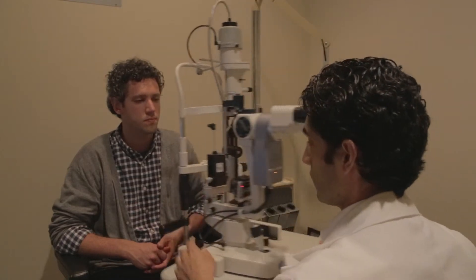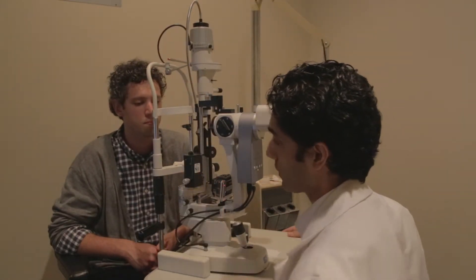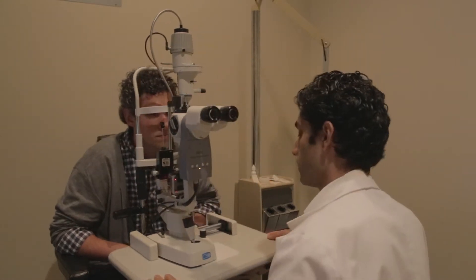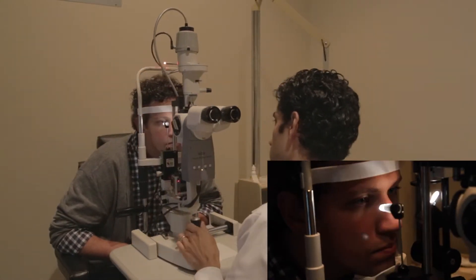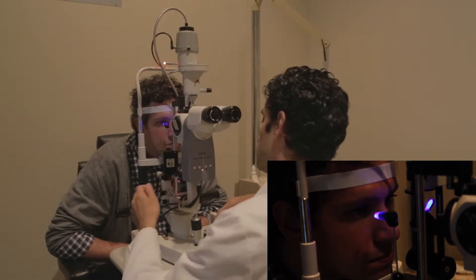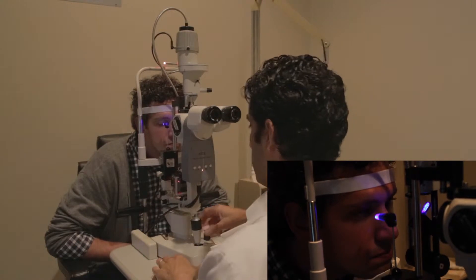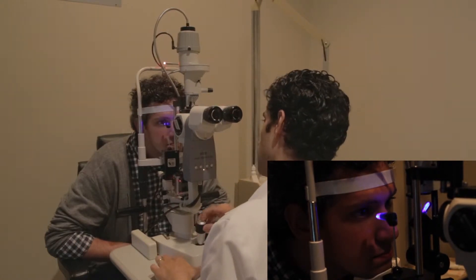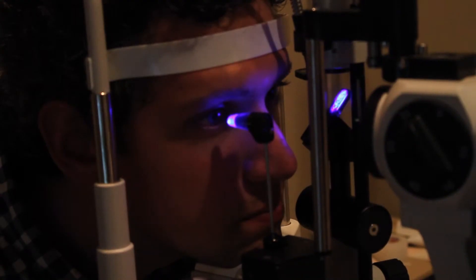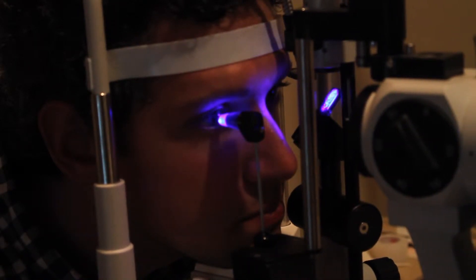Now we're going to introduce our slit lamp. You can see the Goldman tonometer is the device here — we can swing that into place. Turn the light on and select the blue light using the filters at the top. Make sure it's nice and bright, then have the patient look straight ahead and try not to blink.